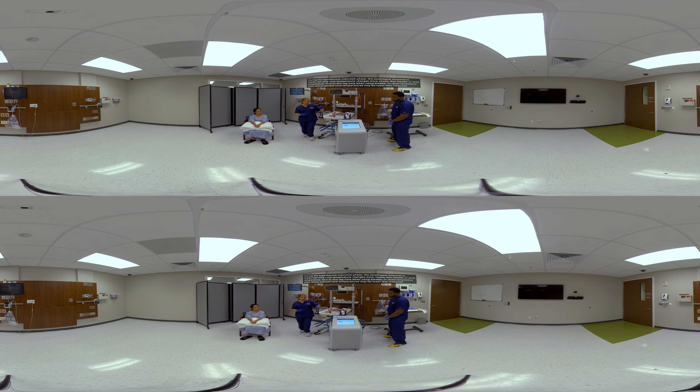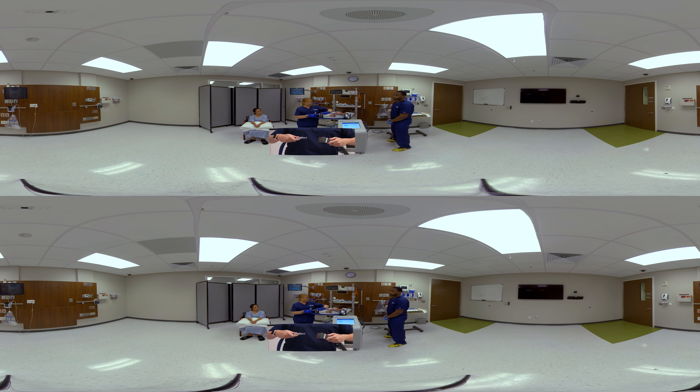Next, we're going to connect the gel pad to the fluid delivery line. In order to do so, you're simply going to line the hoses up with two of the holes on the fluid delivery line. You're going to push until you hear a click. Make sure you steer clear of squeezing the tabs before you introduce them into the fluid delivery line. You'll push until you hear it click.